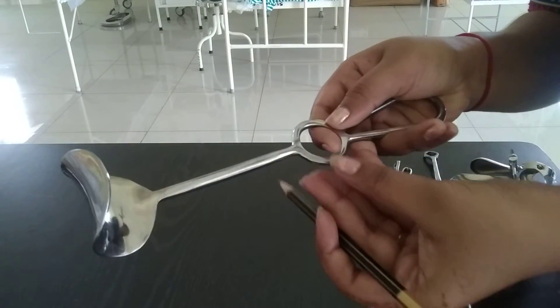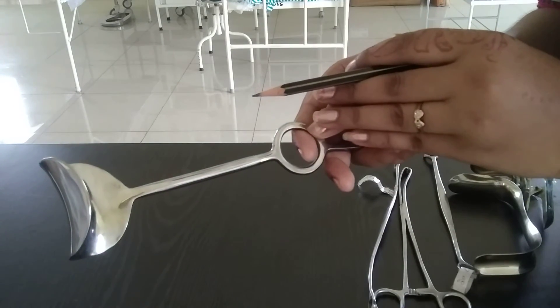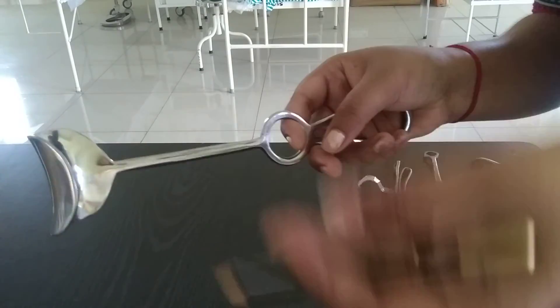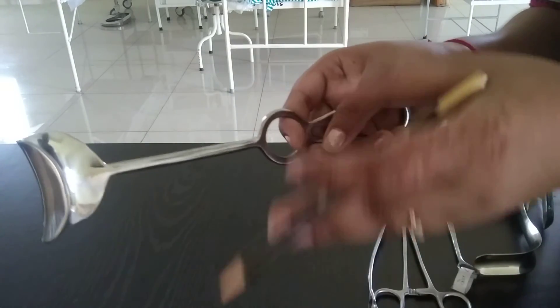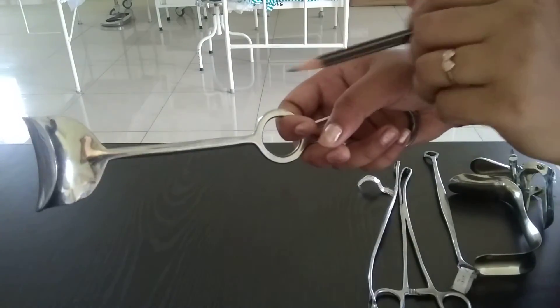When we are using this instrument in gynec — in abdominal hysterectomy to retract the abdominal folds, and in laparotomy to retract the abdominal wall and bladder.